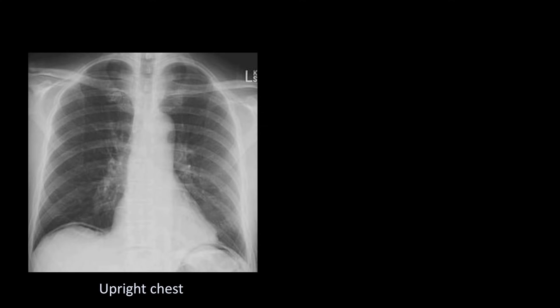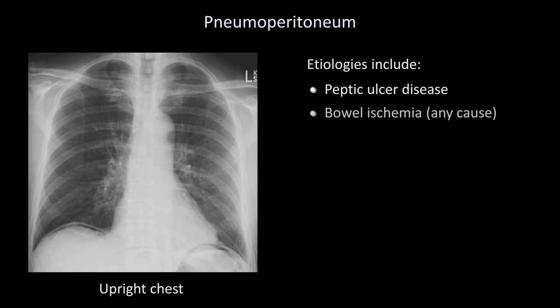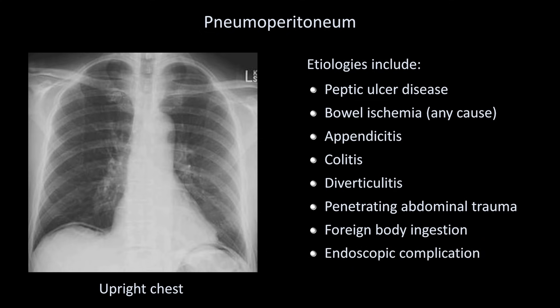Moving from abnormalities of intraluminal gas to those of extraluminal gas — there are two main ones to worry about. The first is best seen on an upright chest film. We can see free air collecting immediately under the diaphragm, indicating pneumoperitoneum. The list of potential etiologies is very long, but the main considerations include peptic ulcer disease, bowel ischemia from any cause, appendicitis, colitis, perforation of a diverticulum in diverticulitis, penetrating abdominal wall trauma such as a stab or gunshot wound, ingestion of a foreign body resulting in bowel perforation, and as a complication from endoscopy. Pneumoperitoneum can also be observed after laparoscopic or open abdominal surgery.